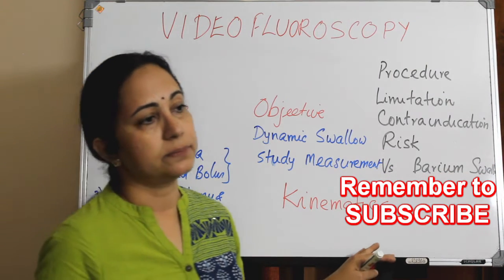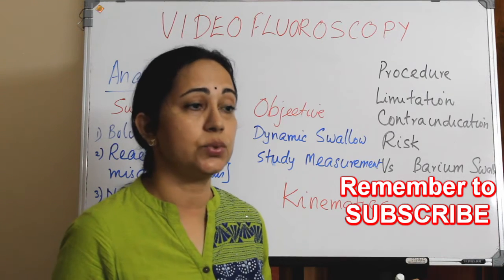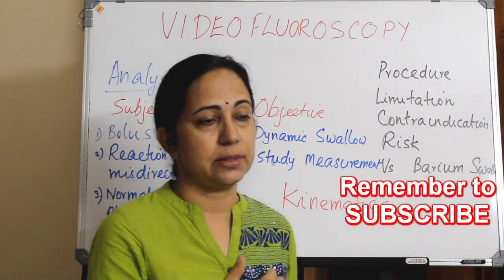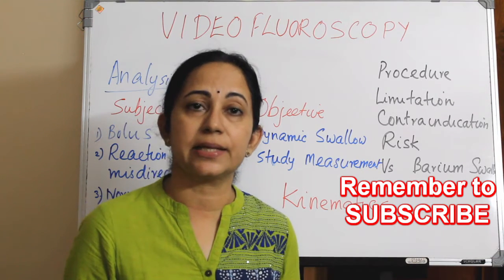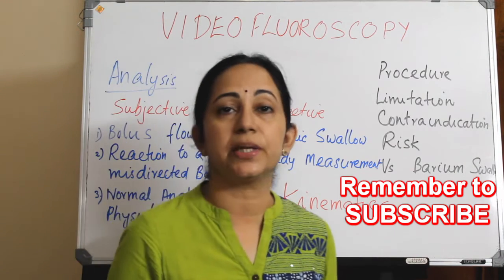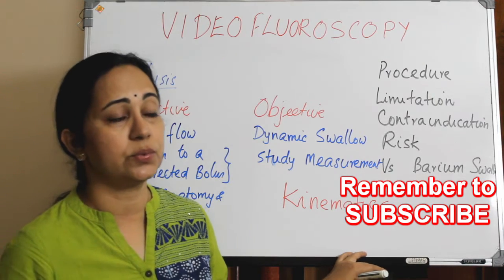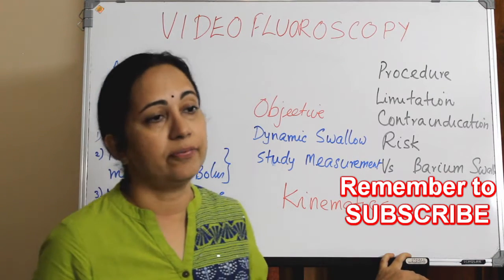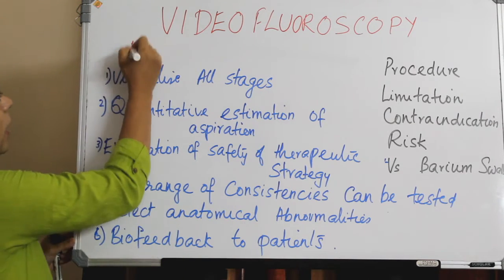In this, there is capturing and manipulation of the digital images using computer technology, so that the exact timings and details regarding the oral transit, the pharyngeal transit, laryngeal valving, and also the penetration and aspiration, all details can be obtained. If you want to know the exact methodology, it is beautifully given by Leonard and Kendall, and you can refer to that. These are the advantages of videofluoroscopy.